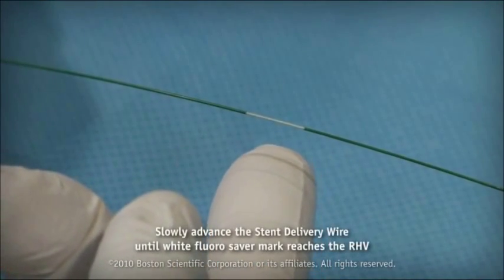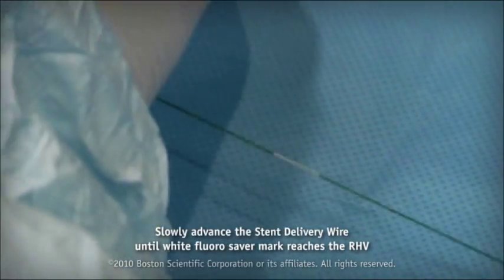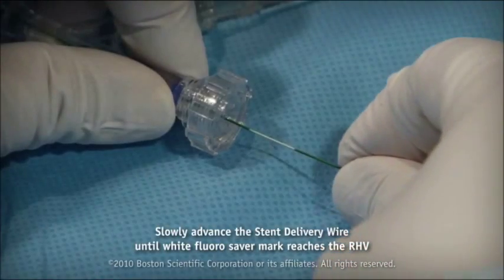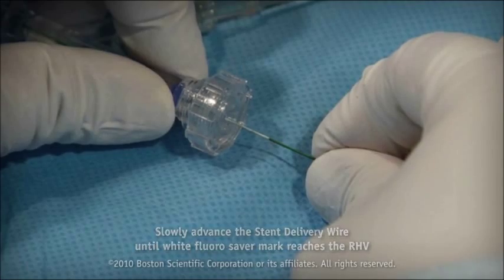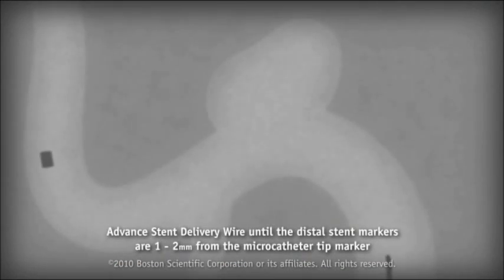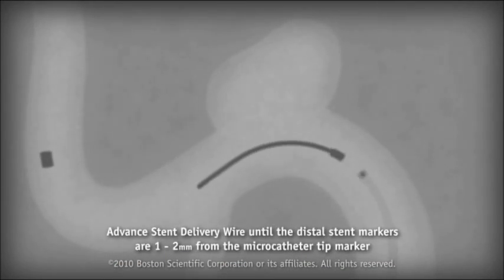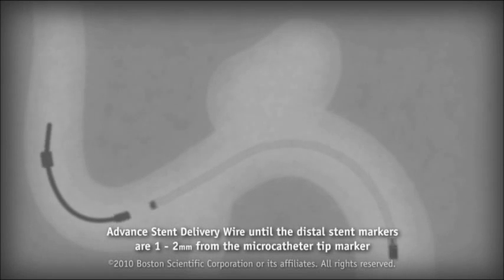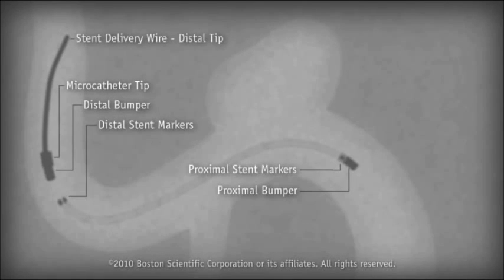Slowly advance the stent delivery wire until the white fluoro saver mark reaches the RHV. Under fluoroscopy, advance the stent delivery wire until the distal stent markers are 1 to 2 millimeters from the microcatheter tip marker.